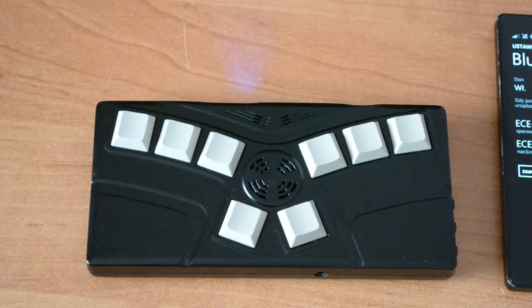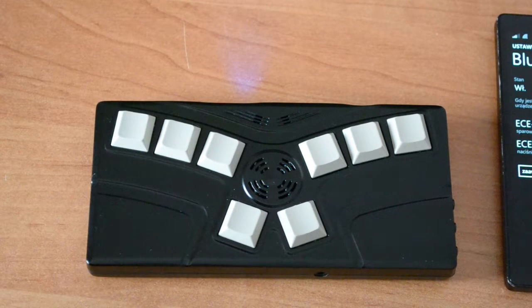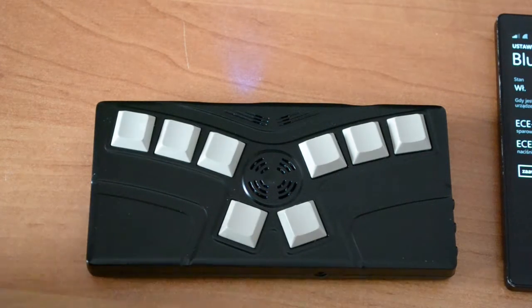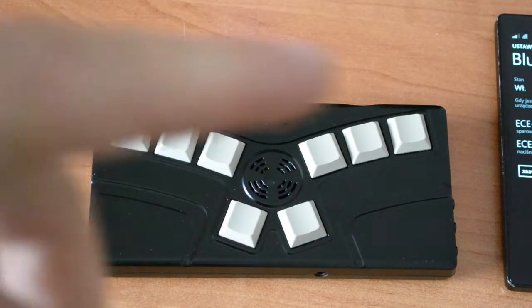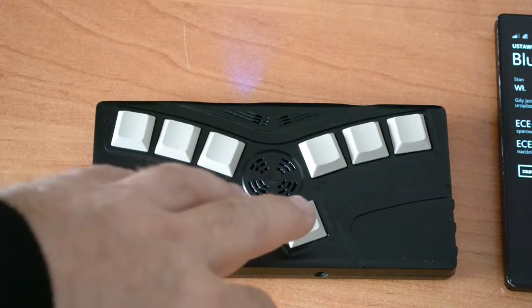Select the default connection mode. Now we can select the connection mode. Keyboard is the first position. Sound. Keyboard and sound. Hands-free device. Because this mobile phone is not voiced, I can use it to answer and make a call, so I will choose the hands-free device.